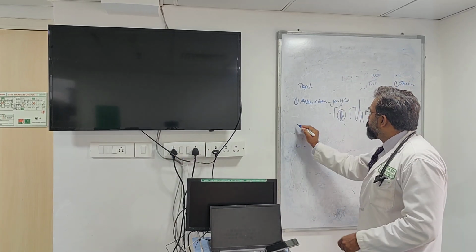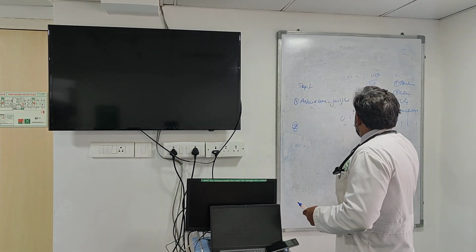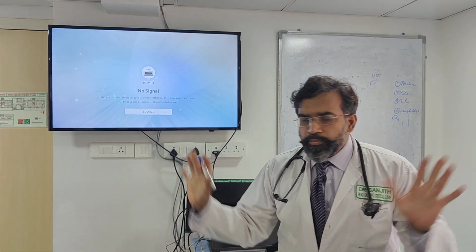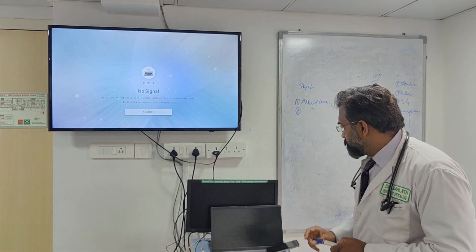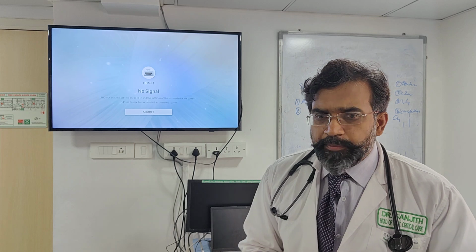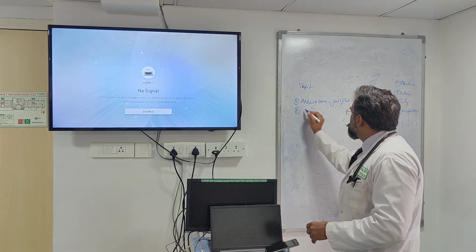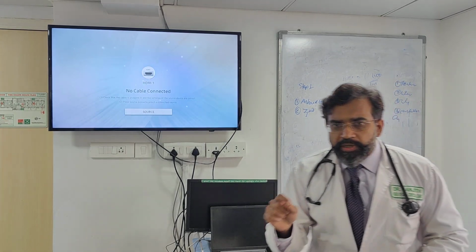Step 1. Step 2. Niharika, step 2. Then sir, we'll see the CVP trace also. We'll do zeroing. What is step 2? Ensure zeroing. The next step is zeroing. The next step is and always zeroing. There cannot be anything different from that.